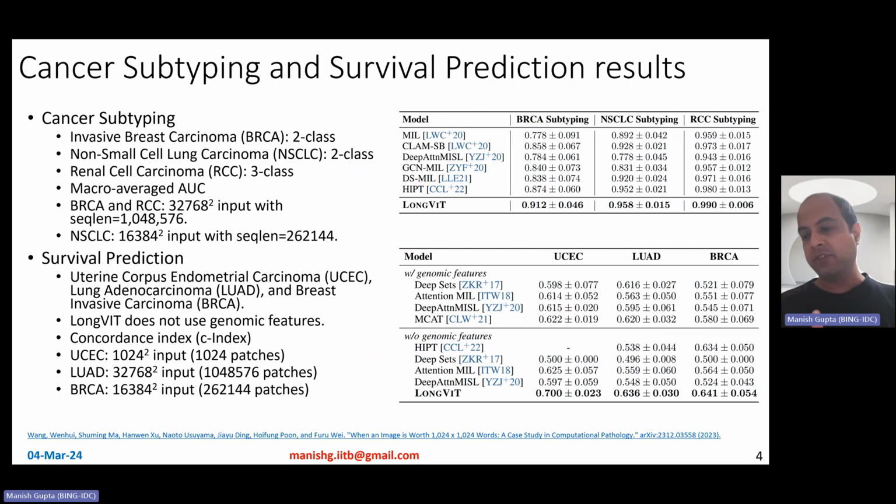So that is how these patches, these images are, right? So the idea is that even if you find a few of those patches which are cancerous in nature, then you can actually mark the entire WSI, the entire whole slide image as abnormal, or as a particular kind of cancer. So this basically makes us think that this is more like a multi-instance learning kind of a problem. So if you are old school, you might remember multi-instance learning setup.